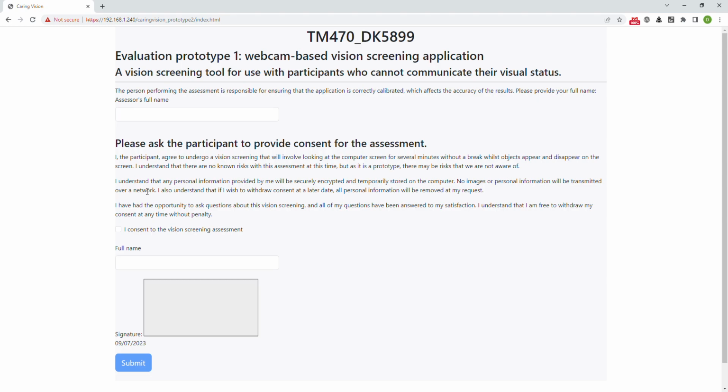The next screen we're looking at now is for the consent. So this is where the participant needs to provide consent, and this is essentially a legal requirement because we're going to be obtaining information digitally from the participant. We're going to be measuring their vision. That's health data, and that's protected characteristics. So we need to make sure that before we do anything, that participant has provided consent that we are allowed to do that, and therefore they're going to fill out the details.